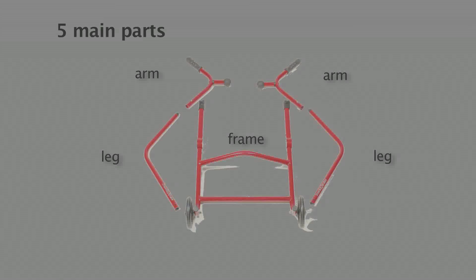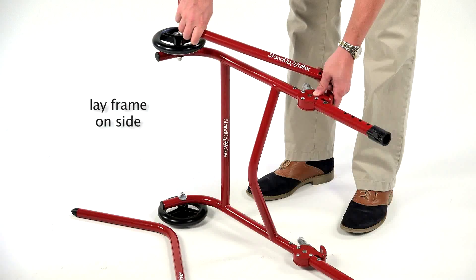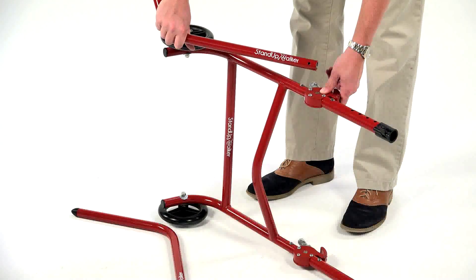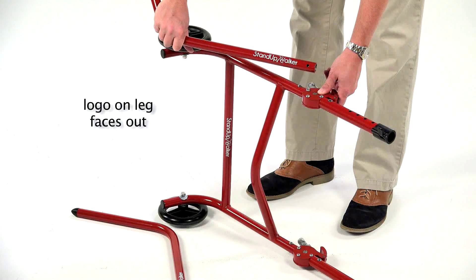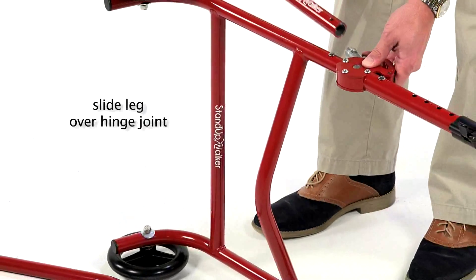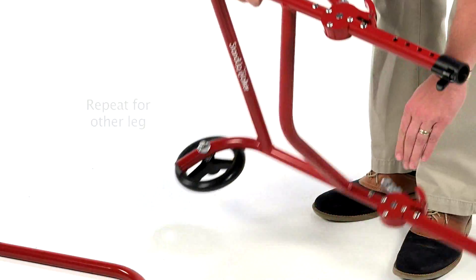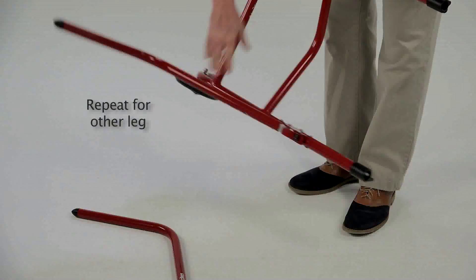To begin, start with the legs. Grab the frame and lay it on its side. Take the corresponding stand-up walker leg to attach to the hinge. The logo on the leg should face out. To install, simply slide the aluminum leg over the hinge joint. Be sure to press the spring-loaded push button down. Repeat these steps for the other leg.